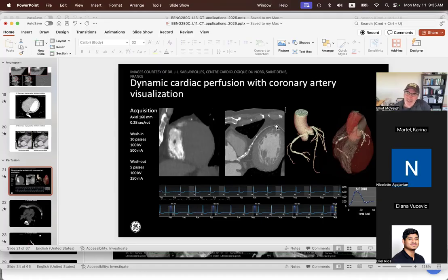And instead of just looking at the coronary arteries themselves and evaluating whether or not they're narrowed down in a way that would cause some kind of flow deficit, you can image the myocardium over time, over heartbeats, to determine whether or not the contrast is actually getting into the muscle. And so here's an EKG of a patient, and we'll take an image every second heartbeat. Here, we'll skip a beat, take another image here, skip a beat, take another image here.